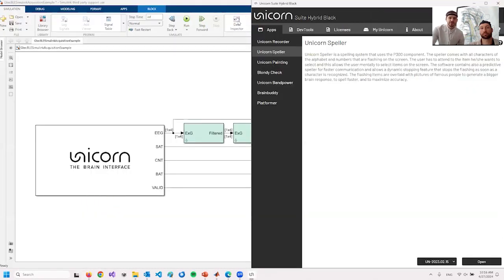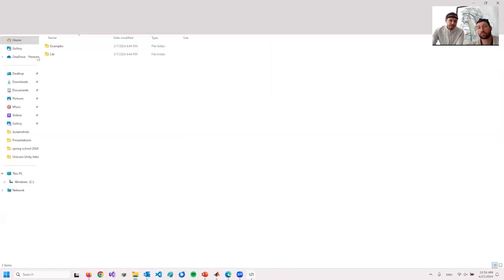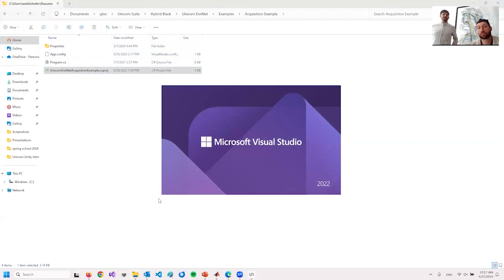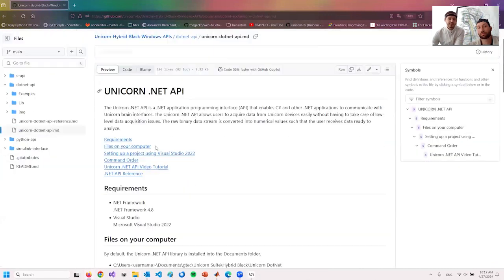And finally, I'd also like to show you some tools for the developers shortly, because I guess some people will also like to play around with raw data or something like that. And in this case, you could use some of the APIs. We have a C API and a .NET API, and maybe opening one of these shortly. You will always find a lib folder, and in the lib folder, there are the binaries that you will need to integrate into your application. And you will always find an example, and the example just shows you how to set up a data acquisition. And to give you an idea how data acquisition usually looks like, I'm now opening the C# API.